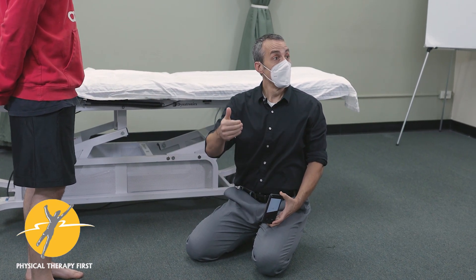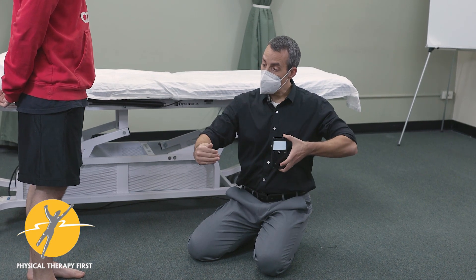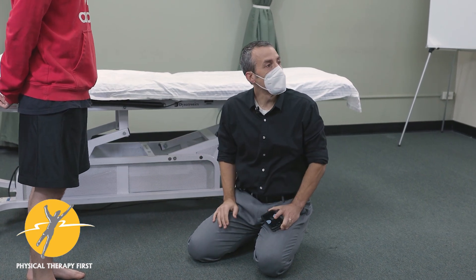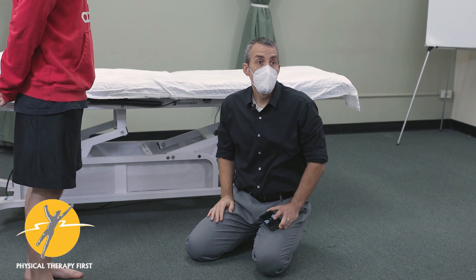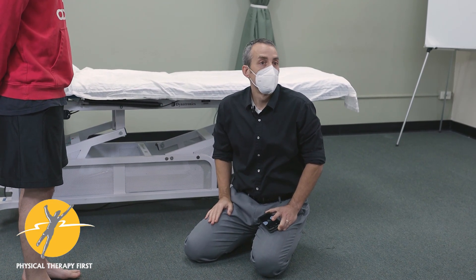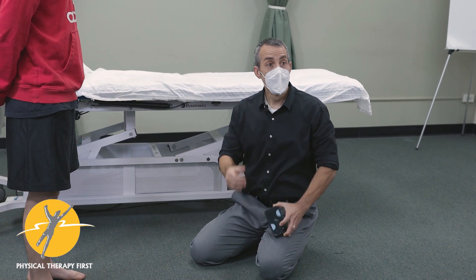In the clinic that approach is more efficient. In research they have to keep everything really clean so it can be validated, but in the clinic this is most likely what you'll do. You perform your technique and then remeasure — it's good feedback for the patient.